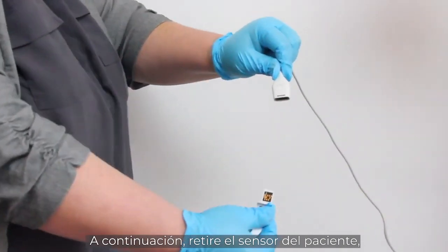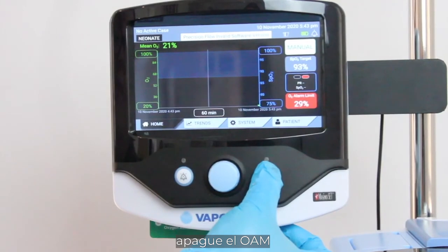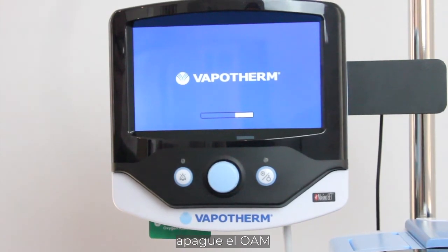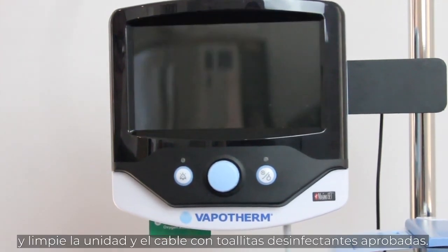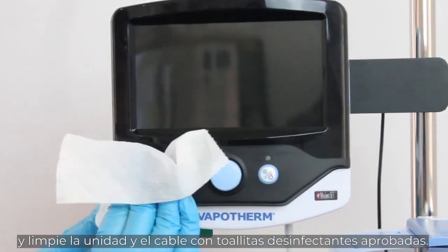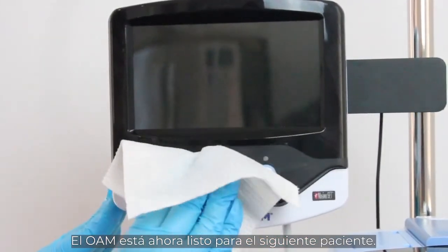Next, remove the sensor from the patient, power off OAM, and wipe the unit as well as the cable with approved disinfectant wipes. OAM is now ready for the next patient.